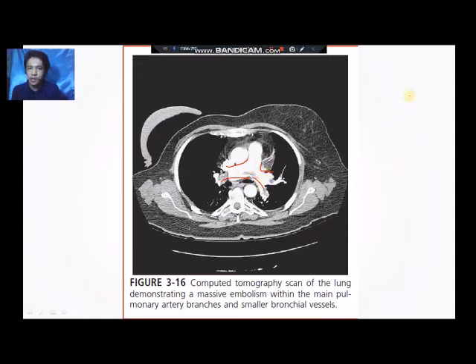So if you imagine, this is a person, a child, with the neck, arms, and body. Okay, so that is approximately the breast of the patient. So this slice is approximately this portion.